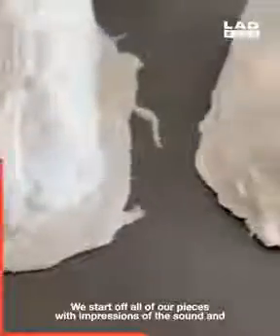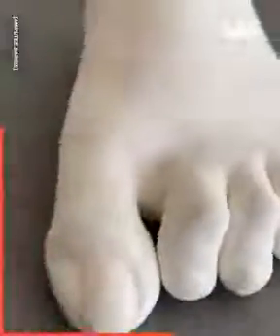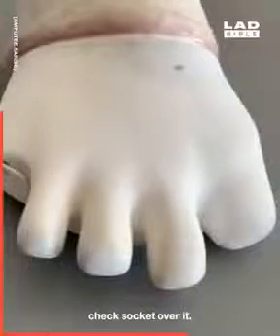We started off all of our pieces with impressions of the sound and affected sides. Here is the plastic model from the mold so we can see form and all of the skin detail when we sculpt. This is the affected side that we've already changed so we can sculpt a check socket over it.